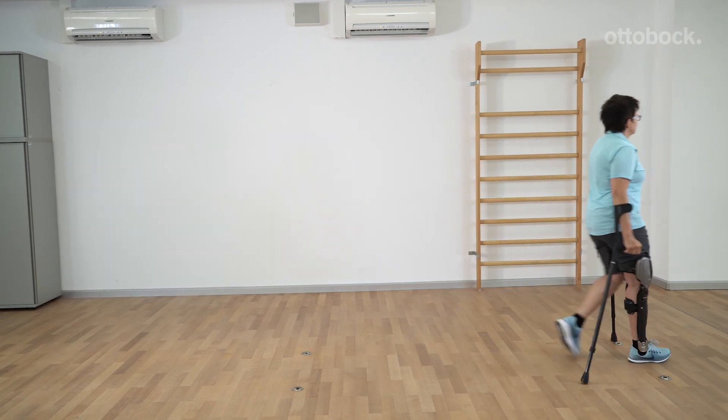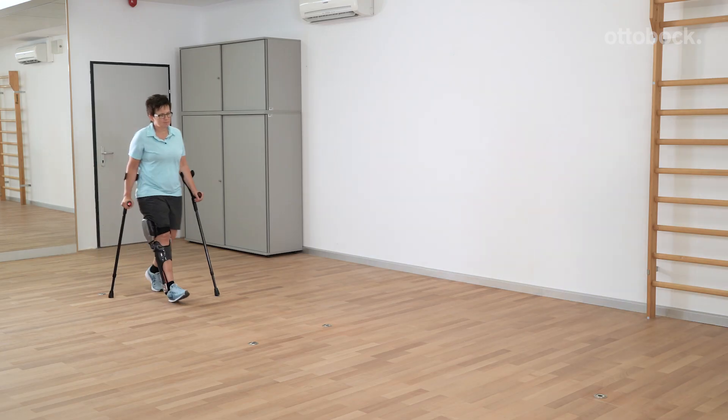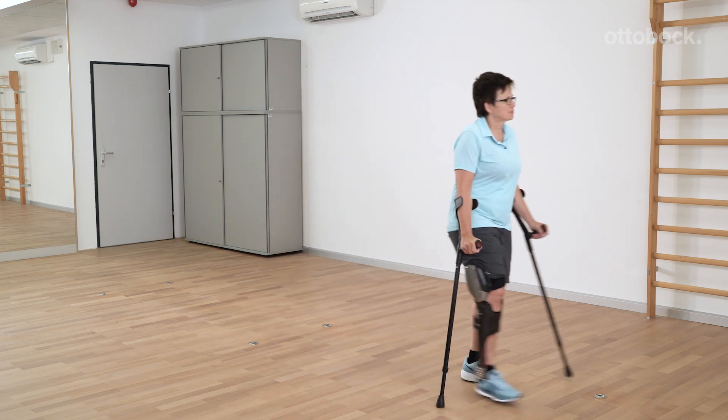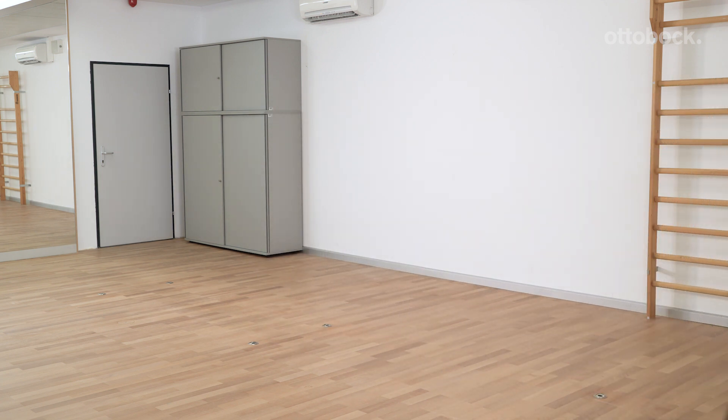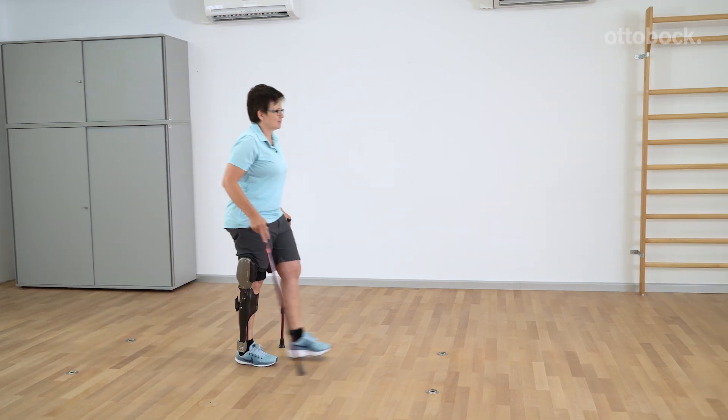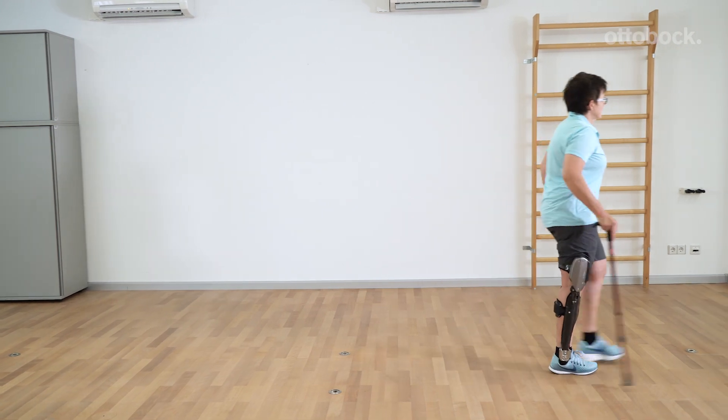Depending on the training progress, to increase the level of difficulty, the patient can practice the two-point gait with two canes.